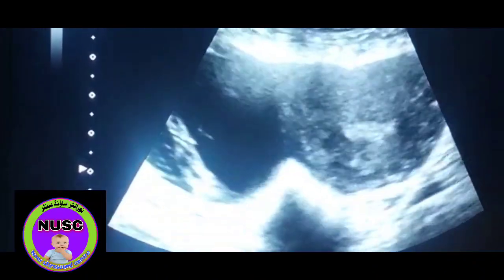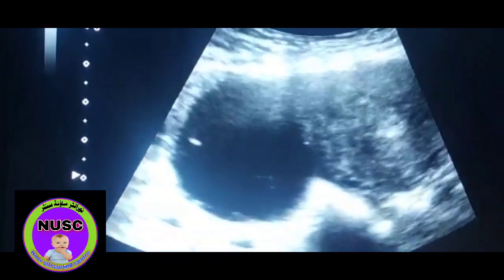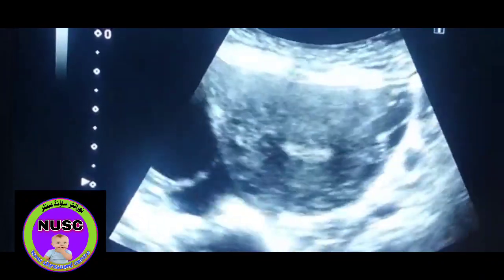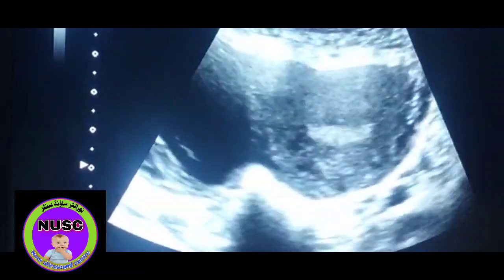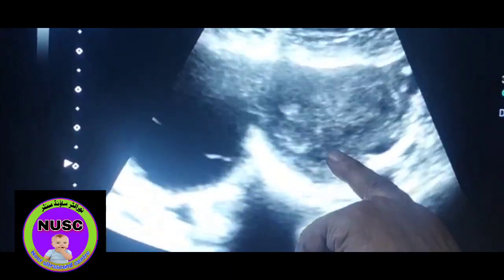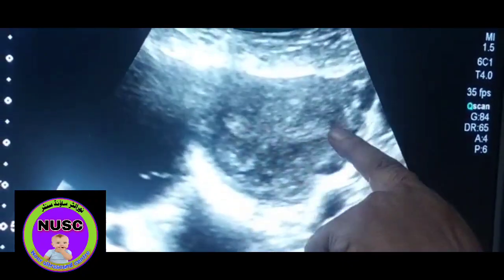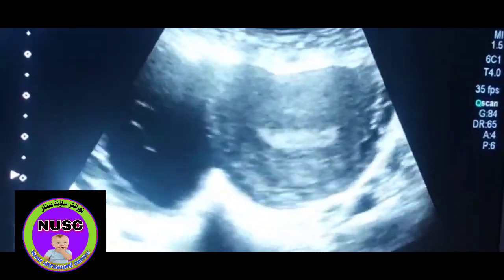Now we are performing a pelvic scan. The patient is complaining of pelvic pain. Here you see this is the uterus — this is a septate uterus. This is the endometrium, and there is a little septum here.